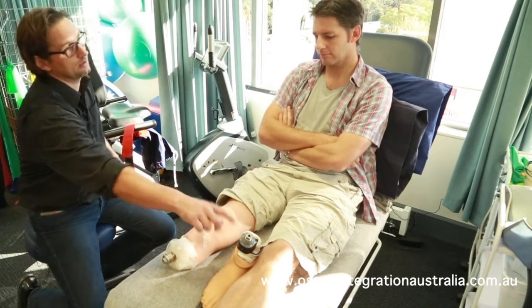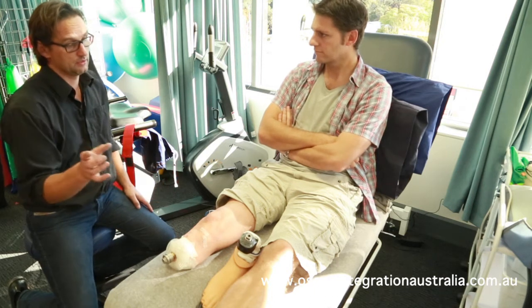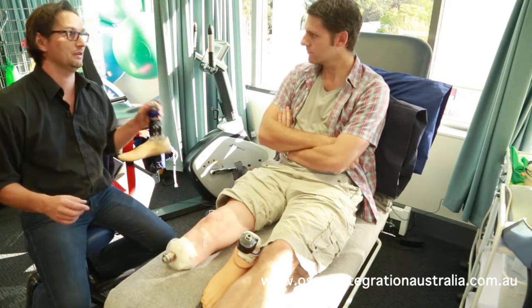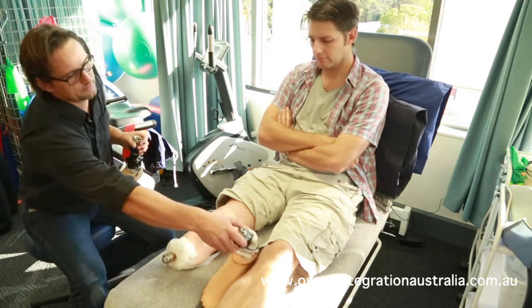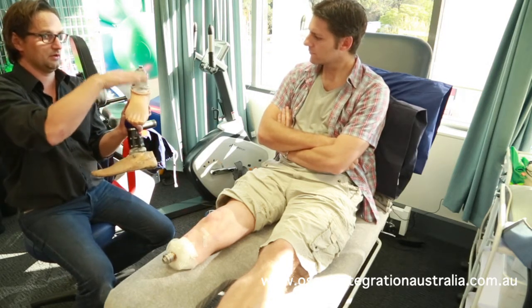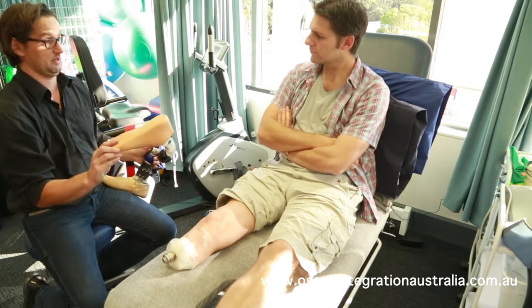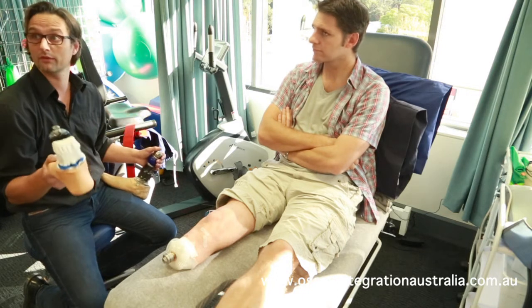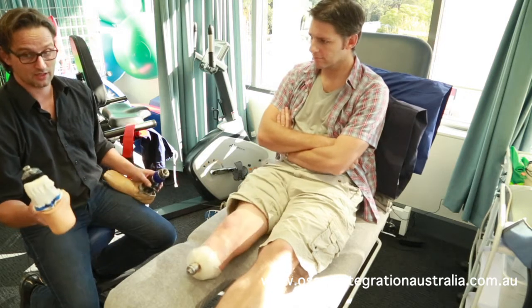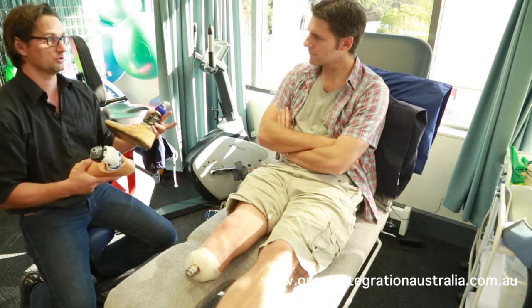On paper that works really well. We tried a couple with a rotator on it on people who came from this one, and they found it really, really soft and flexible. Because this curve here continues — it's kind of like standing a bit on a spring. So people without the rotator seem to love it. I've never heard anything bad about this foot — never, ever. With a rotator, we've had a couple where we included that, and people found it just too much movement.